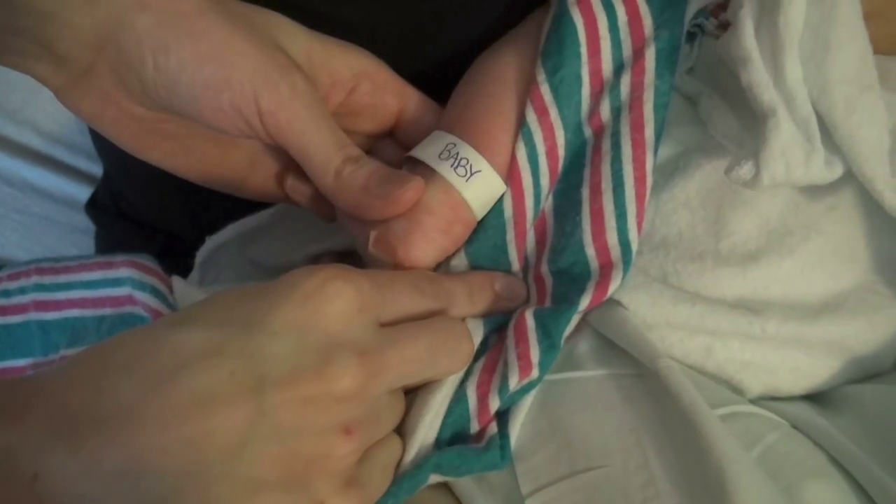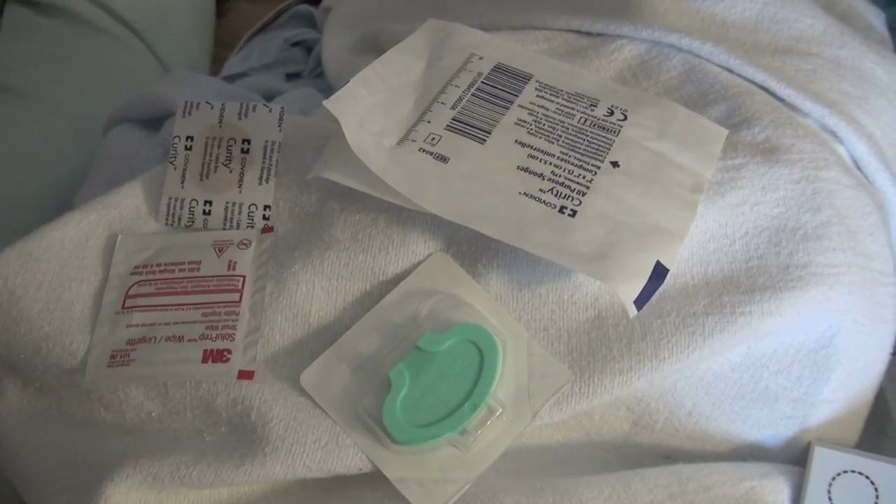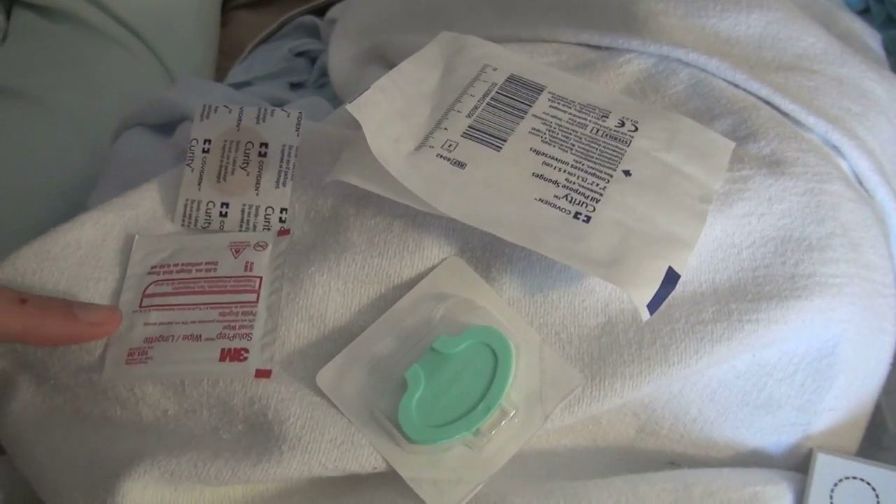Verify the identification of the infant and the infant's mother. Gather the equipment including gauze, band-aid, alcohol swab, and lancet.